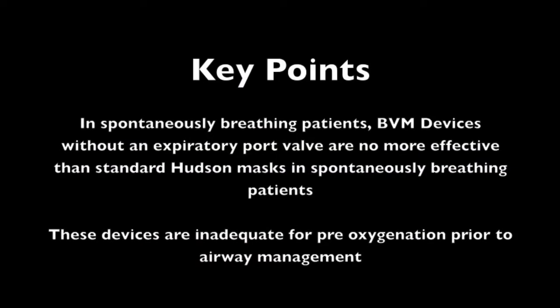In summary, when used in spontaneously breathing patients, bag valve mask devices without an expiratory port valve only provide an inspired oxygen concentration similar to that achievable with a standard Hudson mask. These devices are not suitable for purposes such as pre-oxygenation prior to airway management or resuscitation of spontaneously breathing hypoxic patients in whom a Hudson mask has been inadequate.